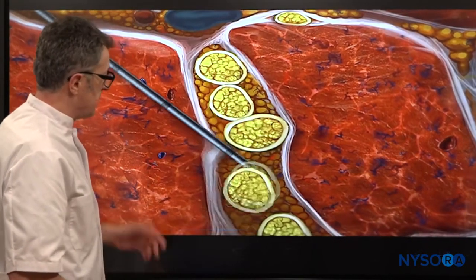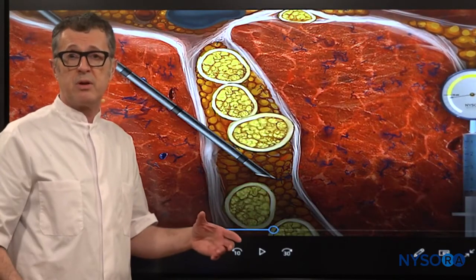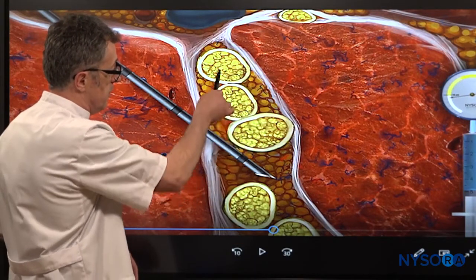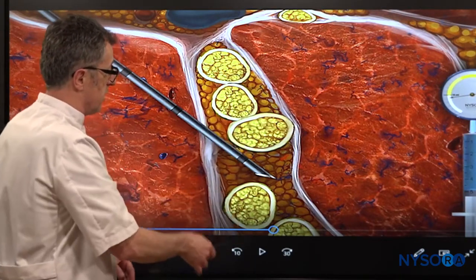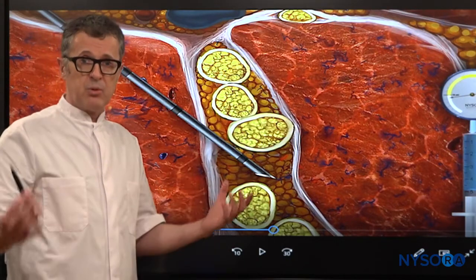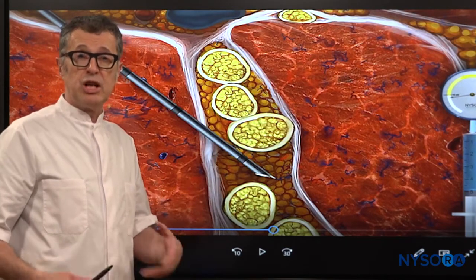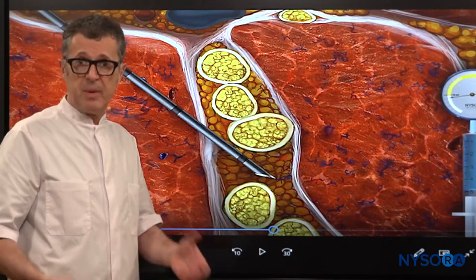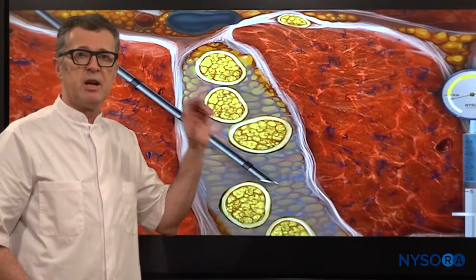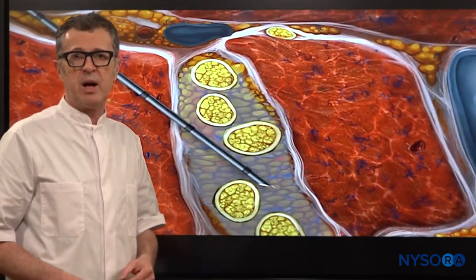And finally, as the needle makes its way inside, before we commit to an injection, we always monitor opening injection pressure. If the needle is lodged into one of these neural elements, into the fascicles, into the fascia, you likely are going to have abnormally high opening injection pressure, the pressure that you need to generate in order to commence an injection. And this is again why we typically use nerve stimulation and opening injection pressure every time we do a peripheral nerve block procedure.